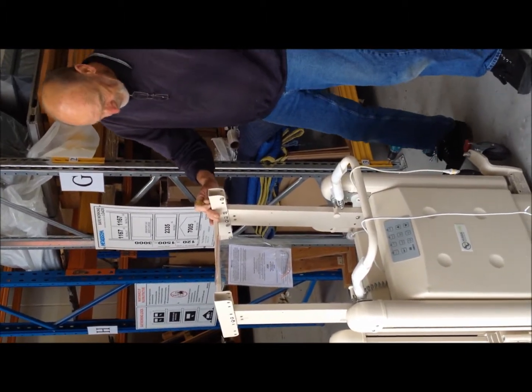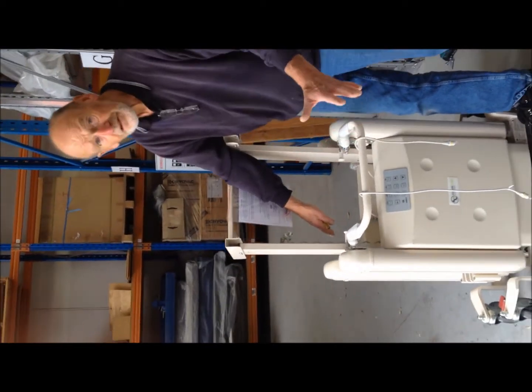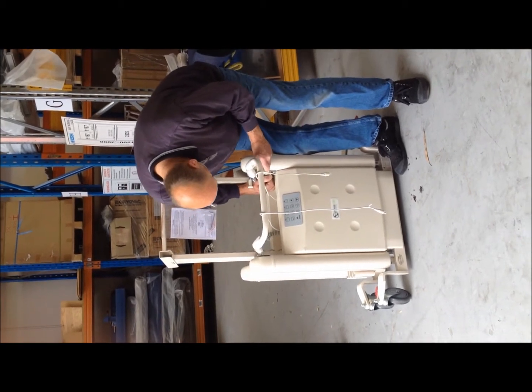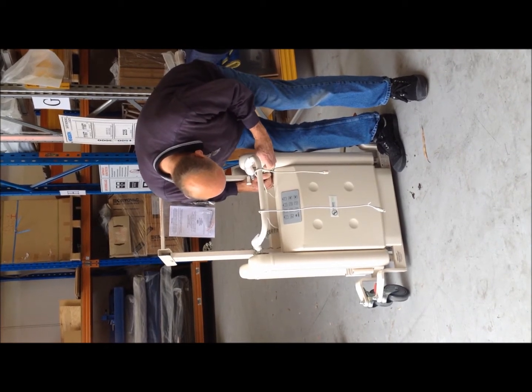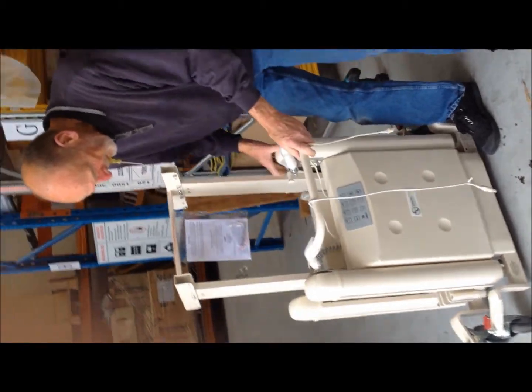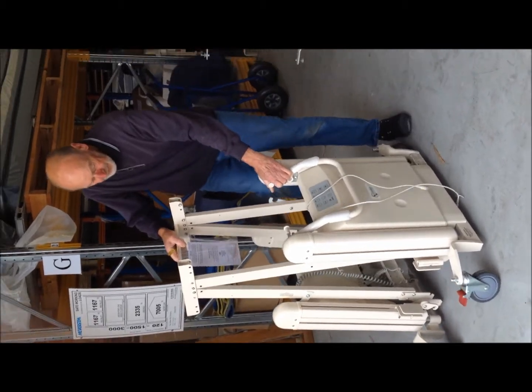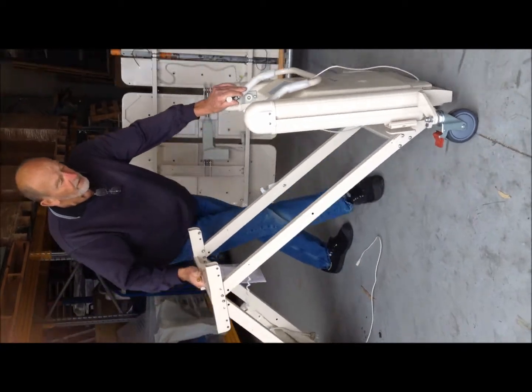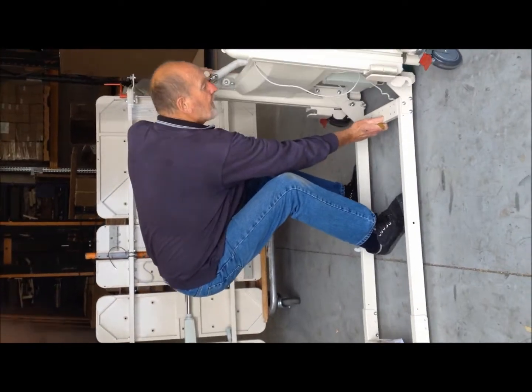I lock the wheels because the bed's going to be going that way. All the bolts are undone, all the wires are free. So what I've got to do is force this to the side a bit and lift up the retaining clip. It's a bit tight. With a little screwdriver, it comes undone. Put that down there, and I just flick this out. And I let the wheels do the job by just letting it slide. When I get to there, we click that in.